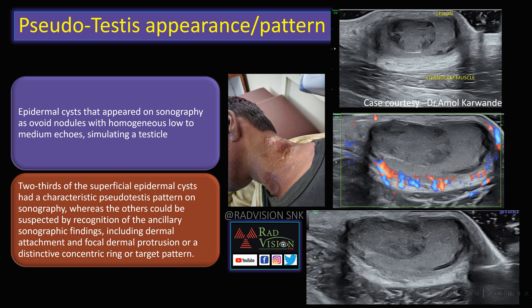The pseudo testis appearance or pattern is very classical for an epidermal cyst. Other sonographic findings that can also be seen include dermal attachment, focal dermal protrusion, and a distinct concentric ring or target pattern. Remember the pseudo testis appearance or pattern in epidermal inclusion cysts.